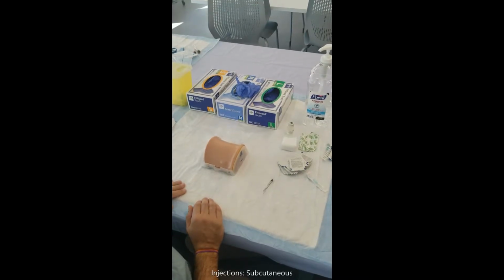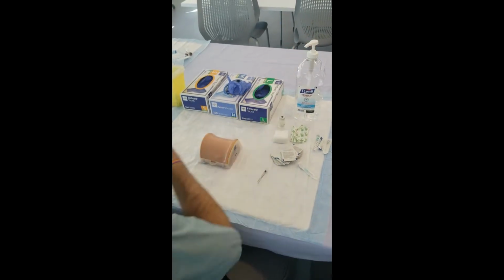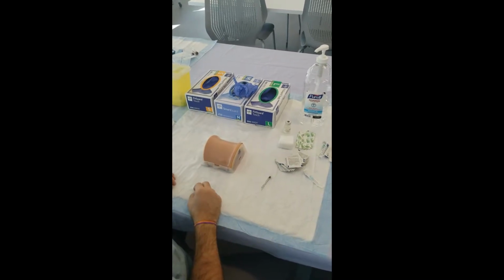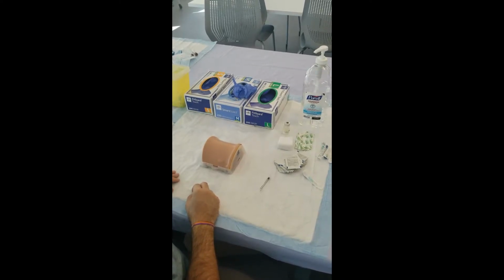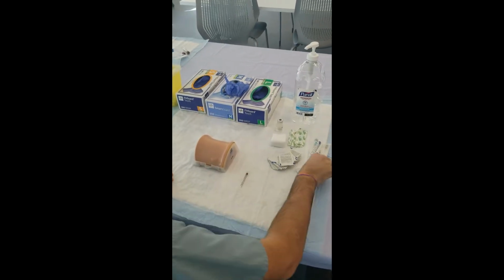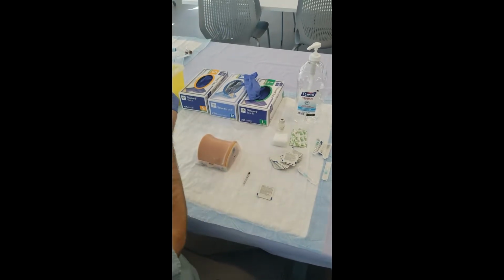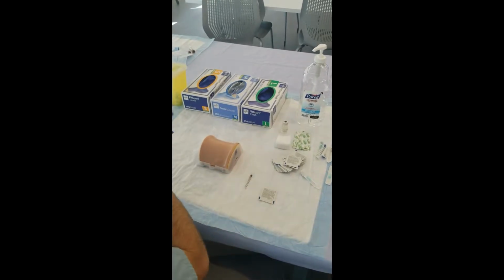Injections, subcutaneous. Step 15, washed hands. Step 16, identified patient using at least 2 identifiers. Items 17 through 19 can be done in any order. Step 17, prepared all equipment. Step 18, put on gloves. If student completed any of the other injection types and was wearing gloves, they may continue wearing the original pair.